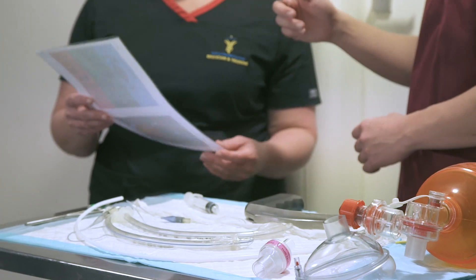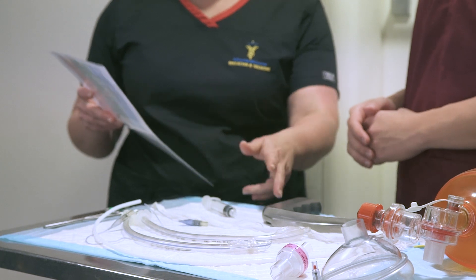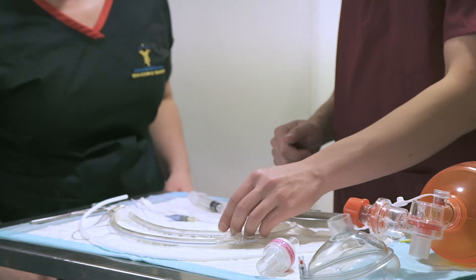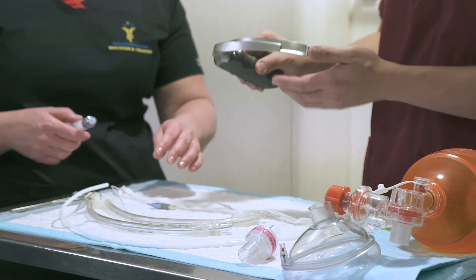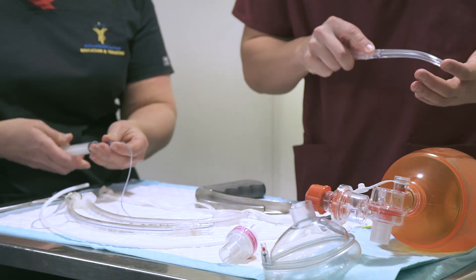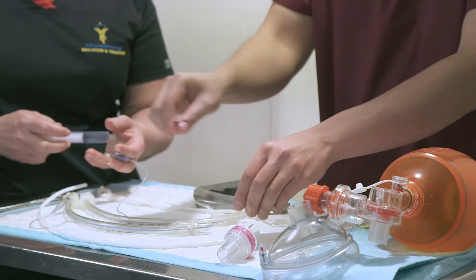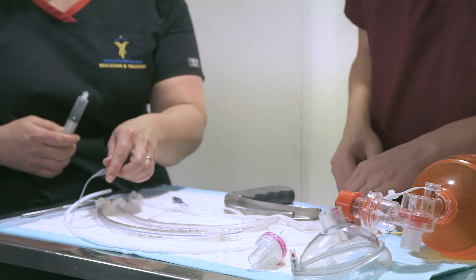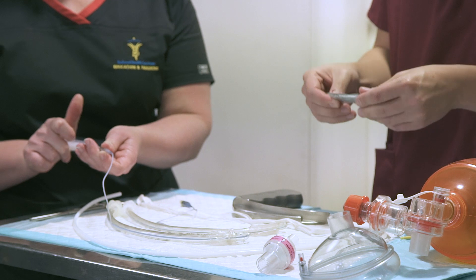The team should consist of four main people: an airway doctor, an airway assistant, a team leader who is also the drug administrator, and an outside runner who remains outside the room. The appropriate PPE should be done by each member of the team. Please refer to your department guidelines.